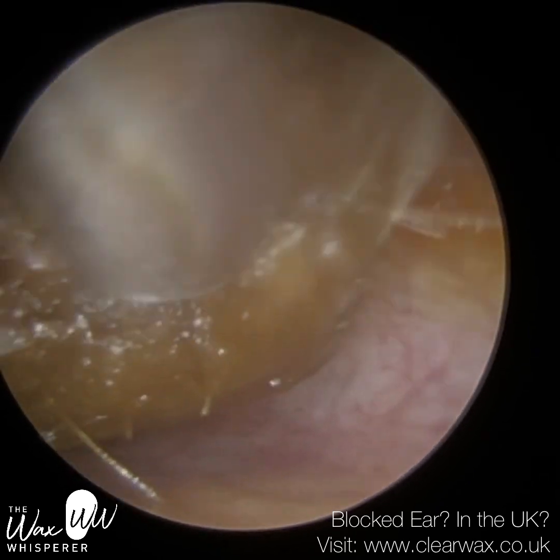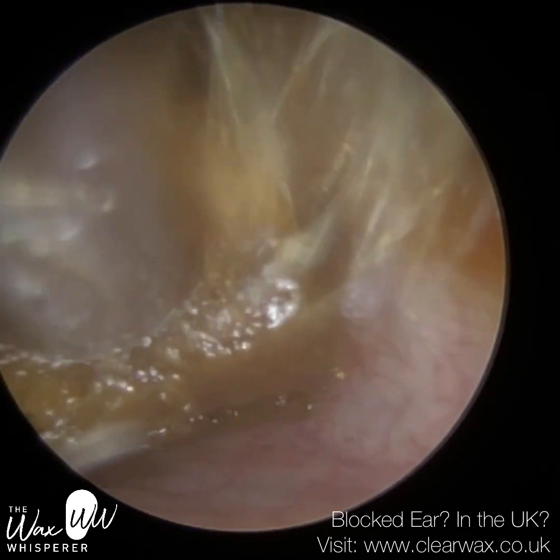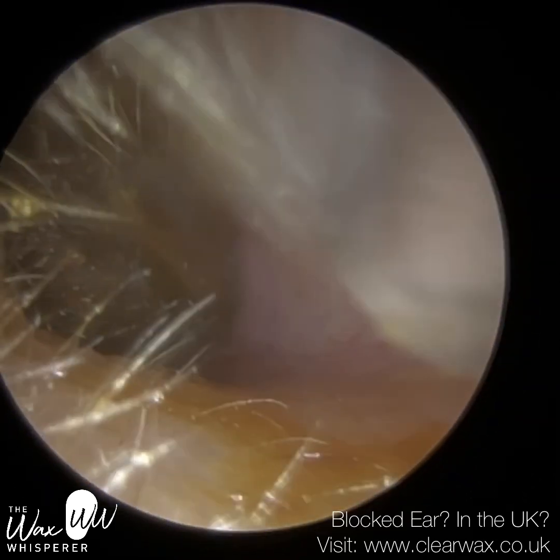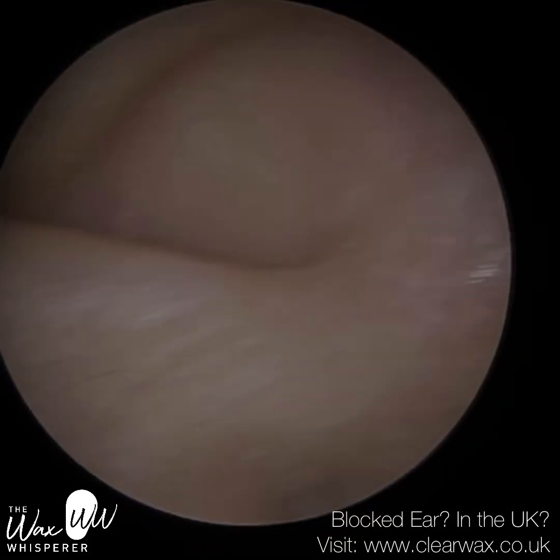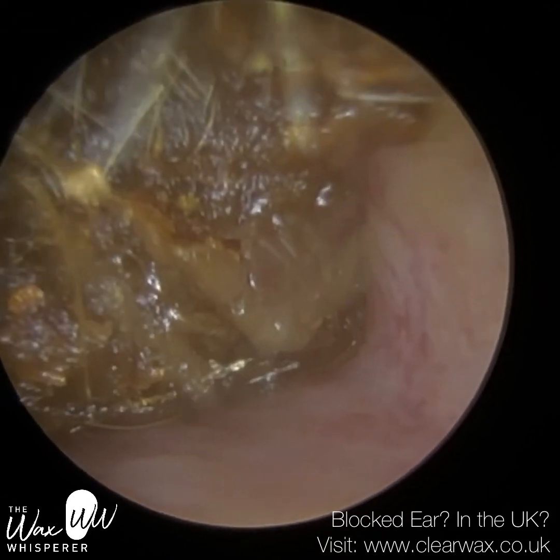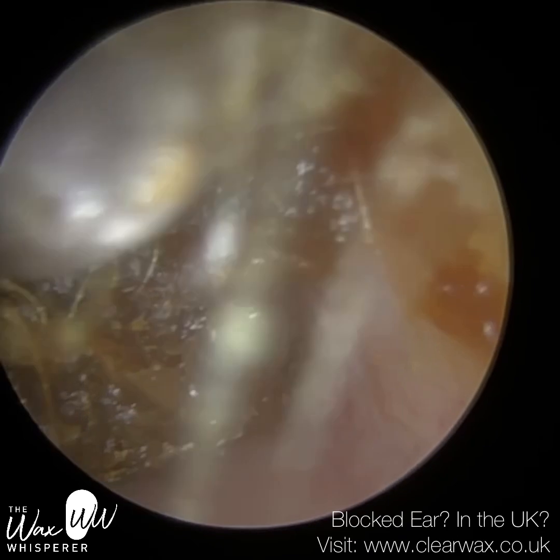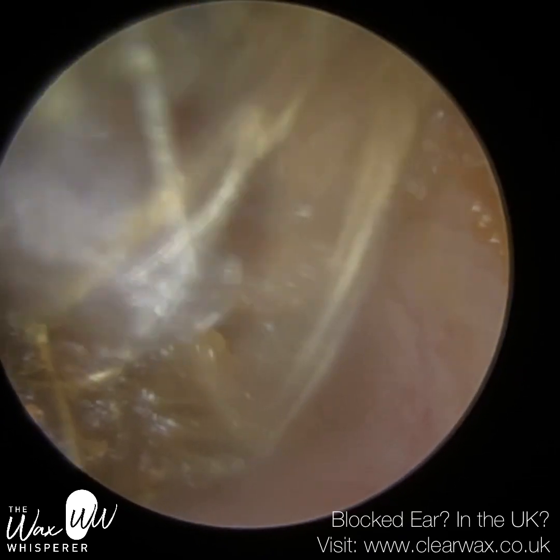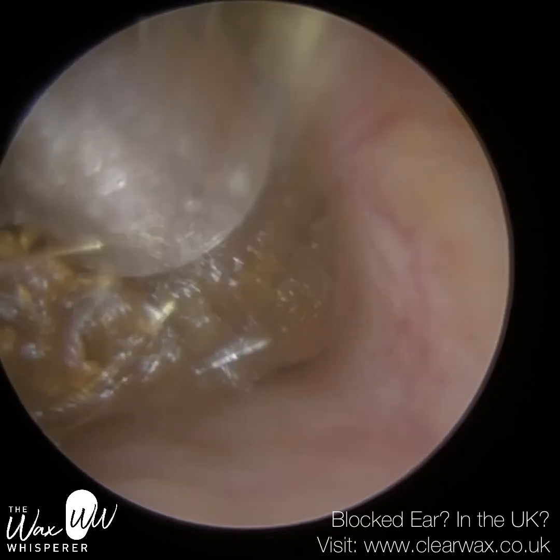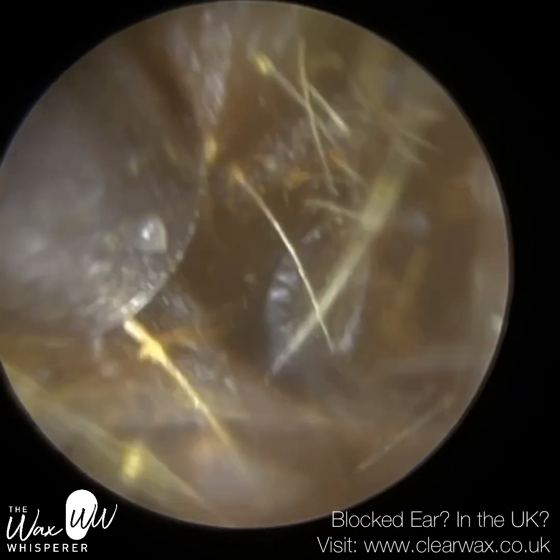Now, this left ear was very bendy. The endoscope is actually positioned directly into the ear canal, but the ear canal veers off to the left. What I'm going to do now is straighten the ear. So I'm lifting the ear up, entering with the endoscope first, and then stretching the ear open. I'm pushing the endoscope to the right hand side against the cartilage to keep the ear canal open. Whilst I'm stretching it, with my wrist I'm angling the tip of the endoscope almost back upon itself to the left, where the ear canal bends and straightens up.